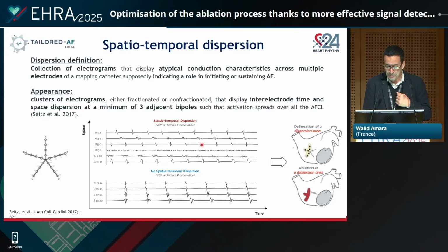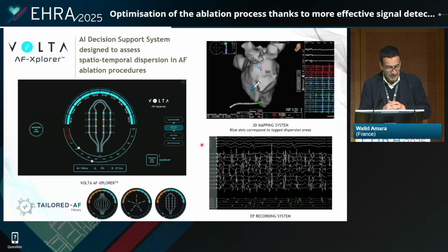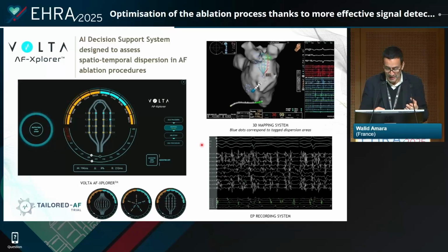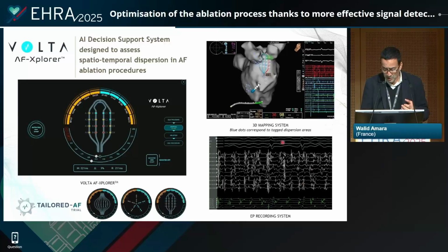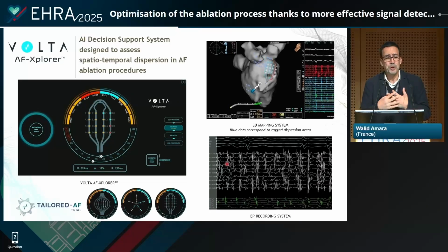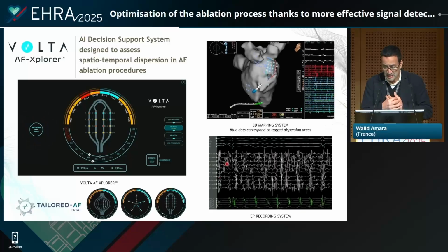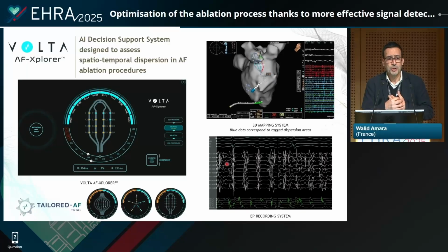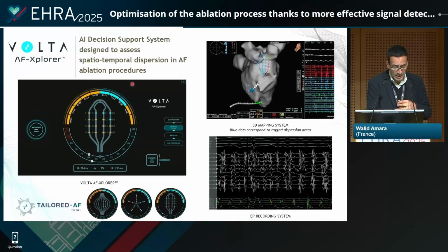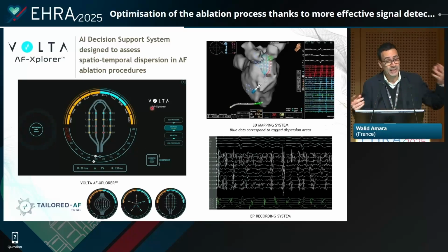But I would be very interested to have a tool that helps me to identify the area I should go to. And that's what's amazing, and I will let you have your analysis about that. Look into the signal that you may see there. In my personal view, it may be difficult. What is fragmented, what is dispersion, is not easy. That means that I would be very interested to have more data on that.